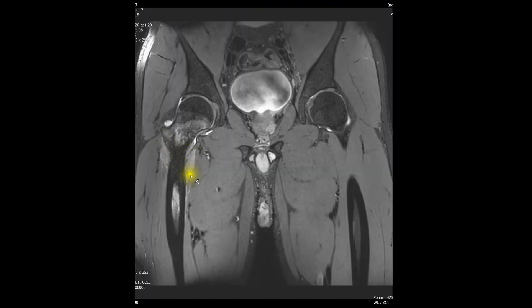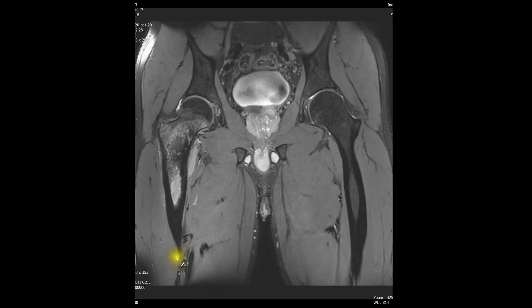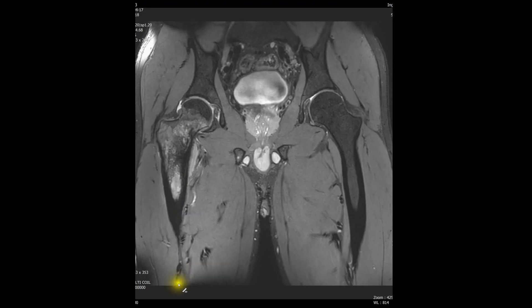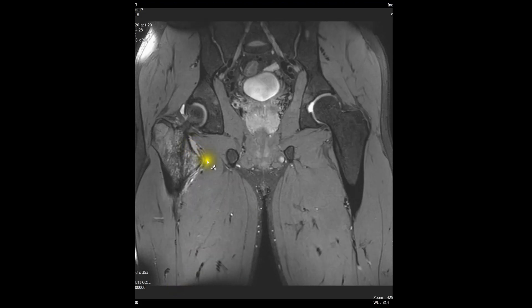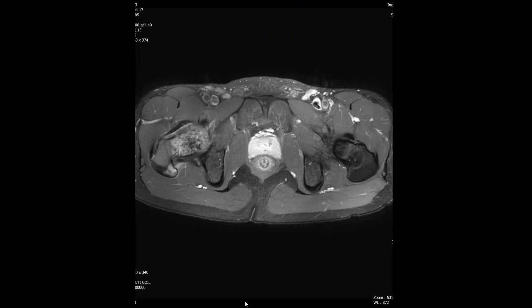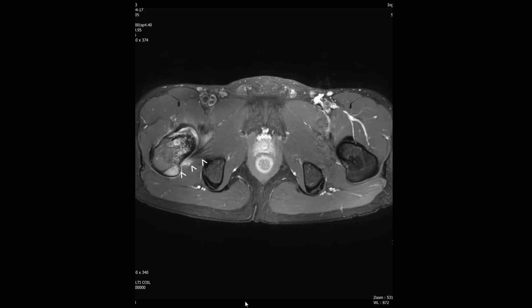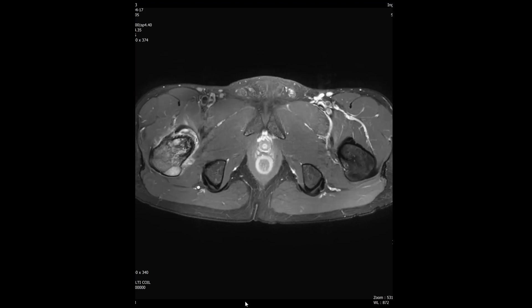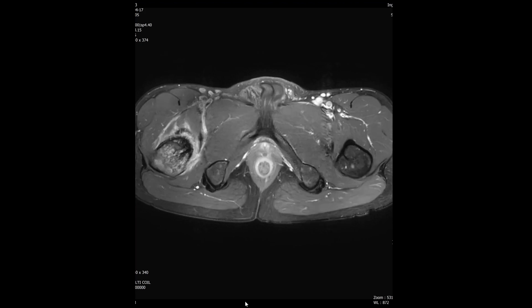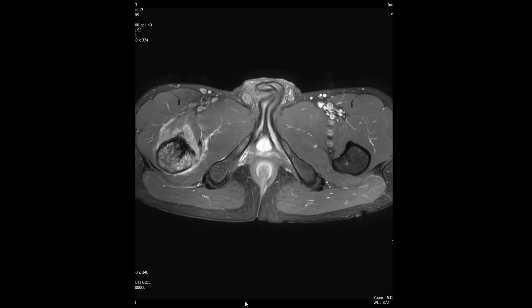On post-contrast sequences, there is diffuse homogeneous enhancement within the intramedullary space, along with enhancing extraperiosteal soft tissue extending around the neck and lesser trochanteric region. The post-contrast MRI sequences correlate well with the ultrasound findings, confirming fluid accumulation in the posterior hip recess and demonstrating extraperiosteal tumor extension along the anterior and medial aspects of the femoral neck and intertrochanteric region. This case is intended to raise awareness of the clinical significance of joint effusion in chronic hip pain, and to emphasize careful evaluation of simple radiographs for subtle but critical findings.